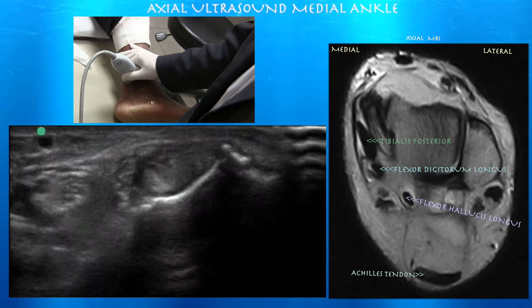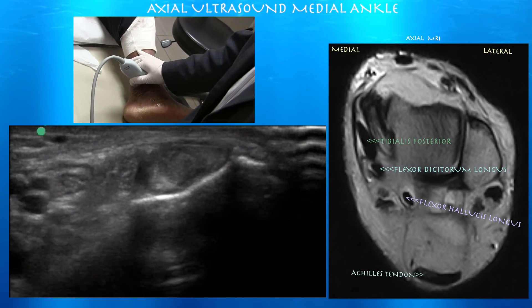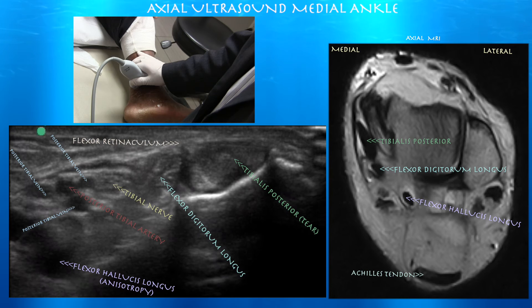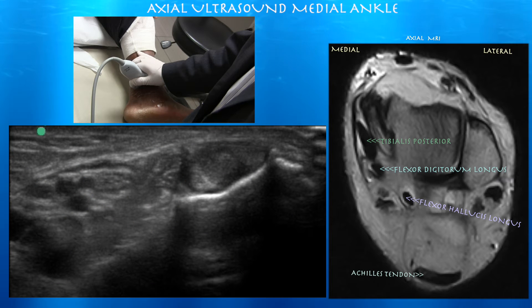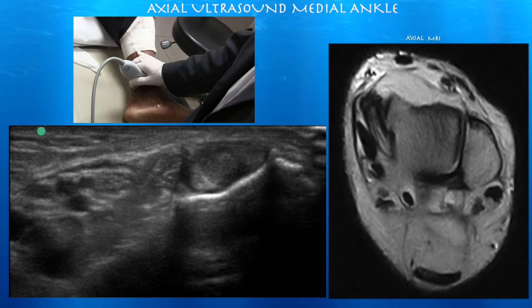You can see here the tibialis posterior tendon is bigger than you would expect. Here are the structures: tibial nerve, flexor retinaculum, and an enlarged tibialis posterior tendon with a tear as well. Sometimes tears in the tibialis posterior tendon can make it look like two separate tendons, so you don't want to get confused and mistake part of the tibialis posterior tendon for the flexor digitorum longus tendon.